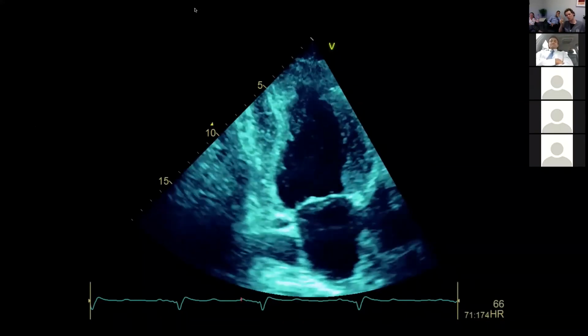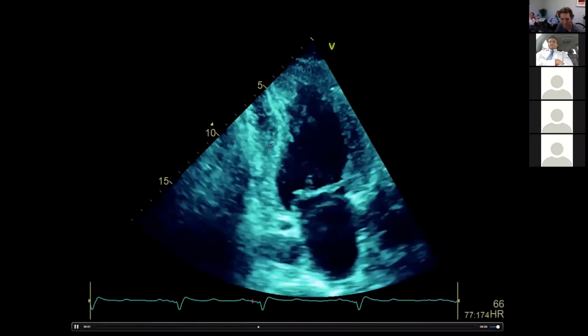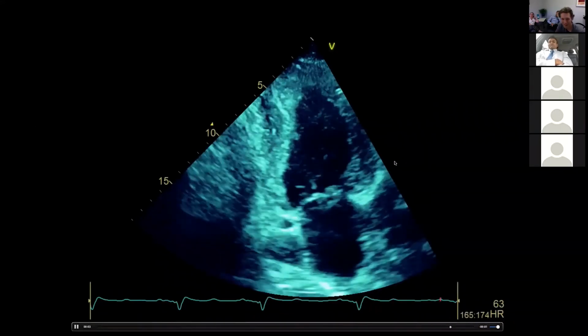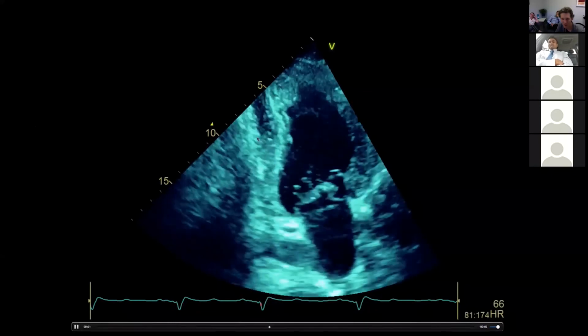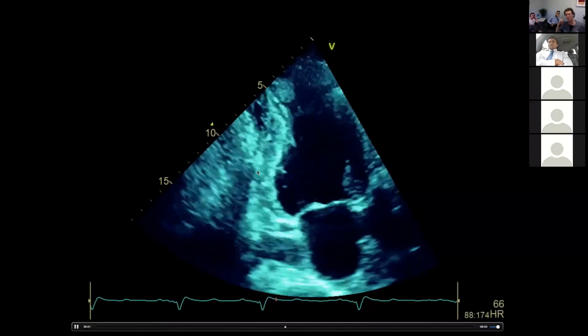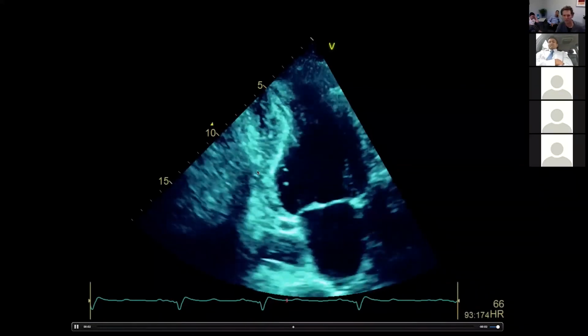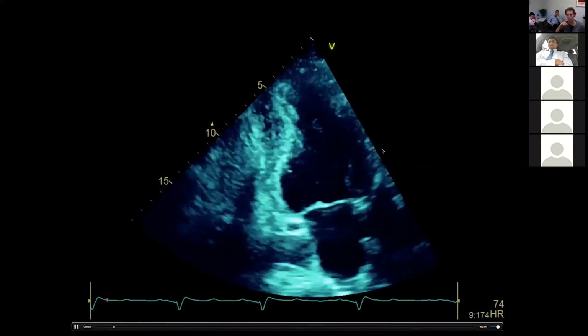So this is meant to be a two-chamber. So what's the wall on the left? So this is the posterior wall. Yeah. And that's the anterior wall. Yeah, so classically, I guess we call it the inferior. I think posterior can be called for the infralateral wall. So just try and keep, I think they're normally calling it inferior. So just inferior and anterior probably is more correct.